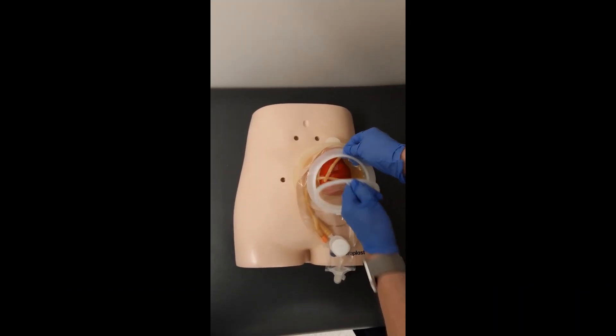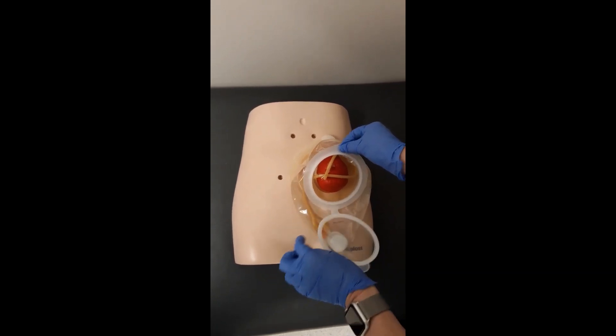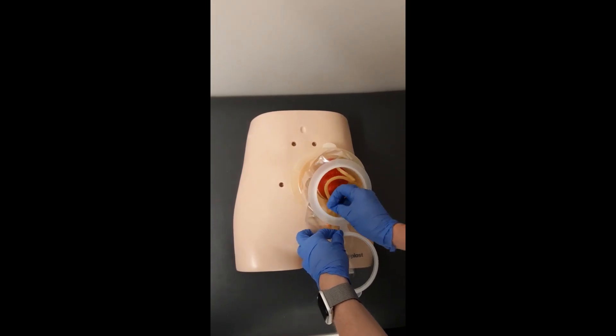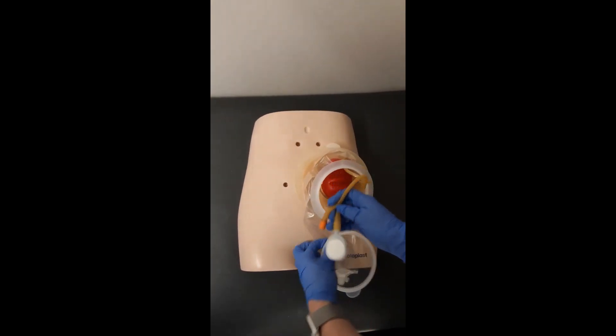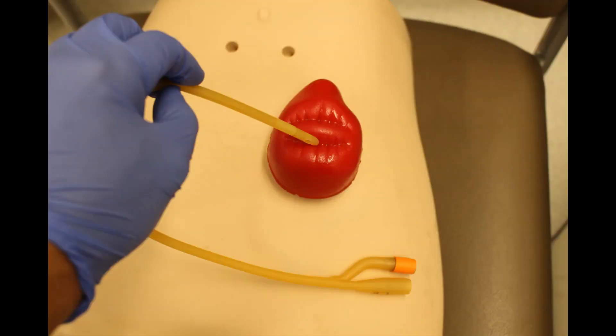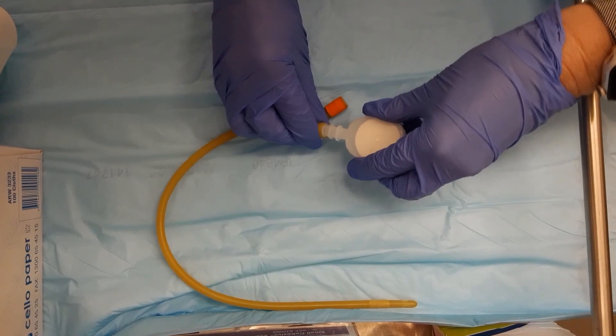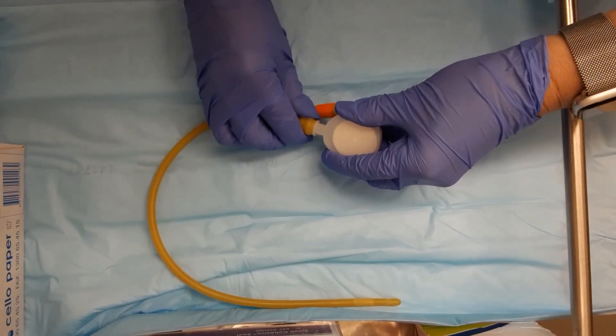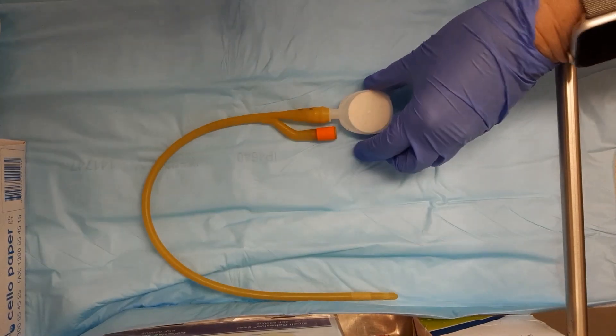A clear window wound management appliance allows easy access to the pump if maintenance is required. A Foley's catheter is cannulated into the distal limb of the fistula; 5ml of water are used to inflate the balloon and the pump is attached to the end of the catheter. Of note is the potential risk of pressure injury from the inflated balloon. The system is also available with custom tubes specifically designed for chyme reinfusion.